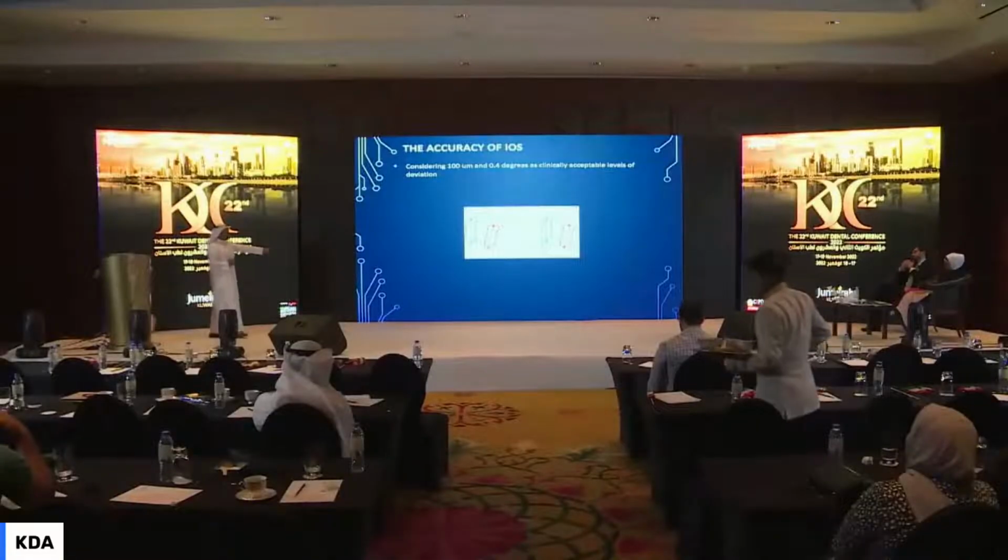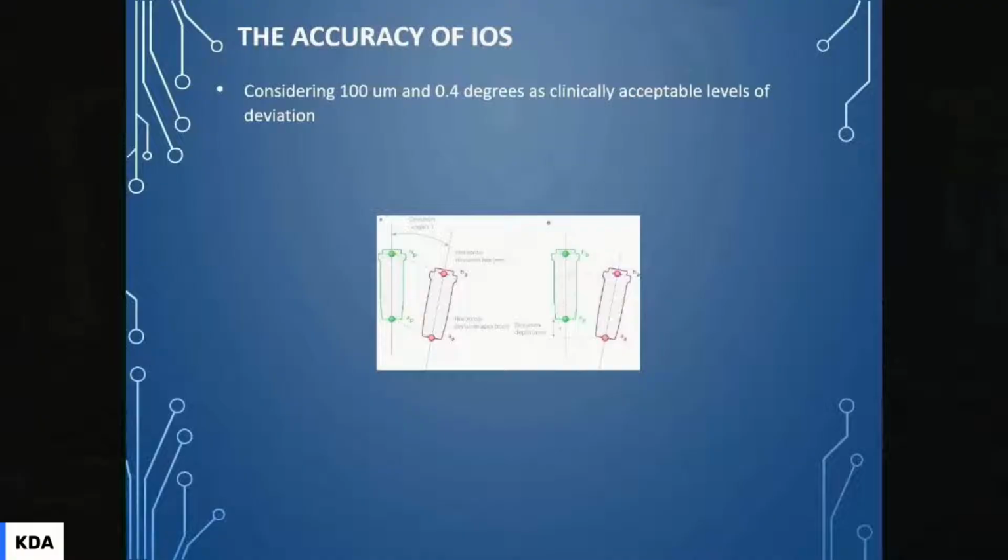What does that mean? That means that if we take a scan, the misfit of our scan should not be more than 100 microns, and the degree of misalignment between the scan and reality should not be more than 0.4.